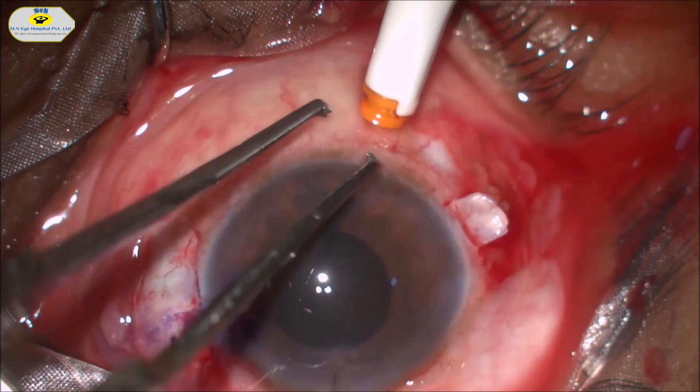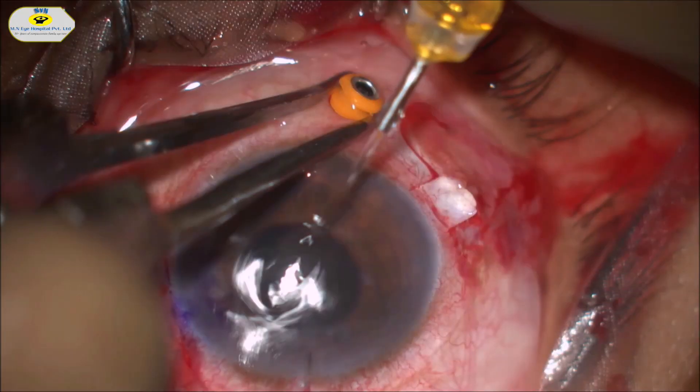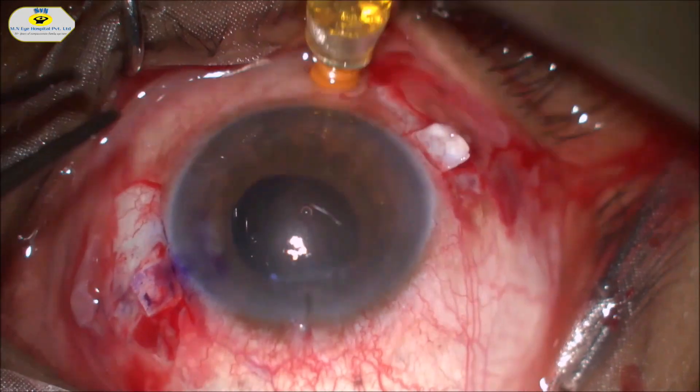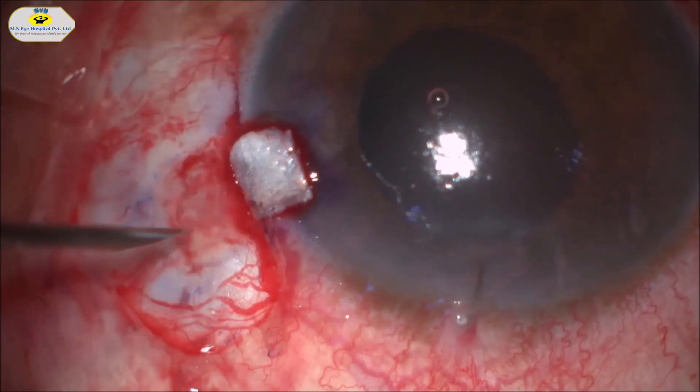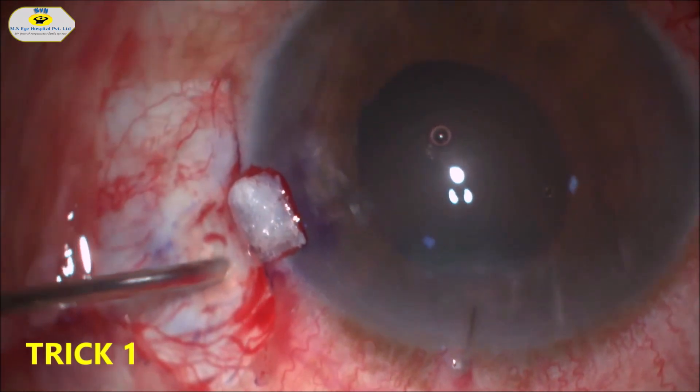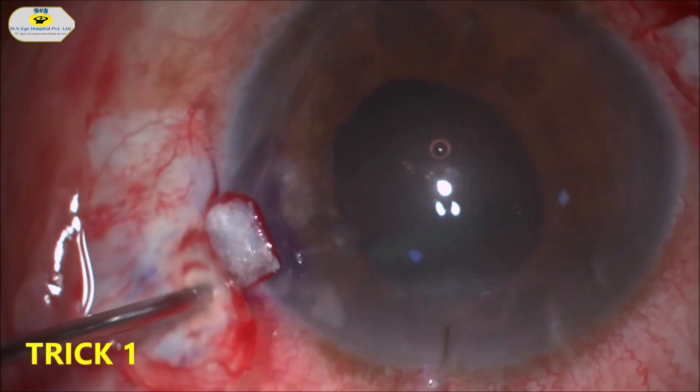A 23-gauge trocar is placed inferotemporally and the infusion cannula is connected. Sclerostomy is done on either side by placing the needle perpendicular to the limbus underneath the scleral flap.